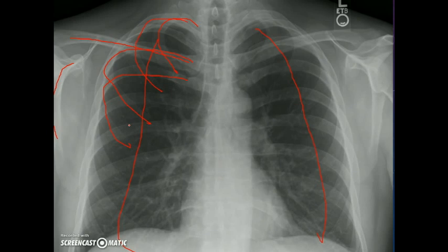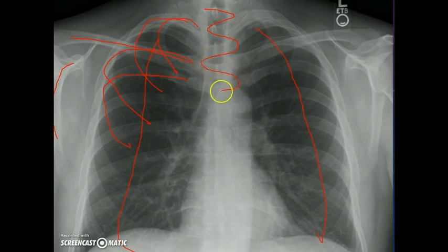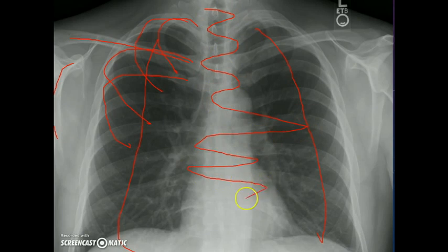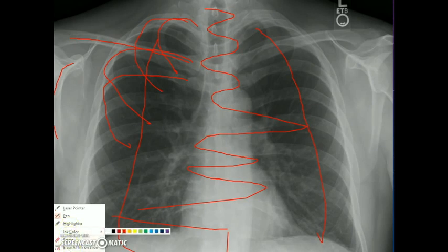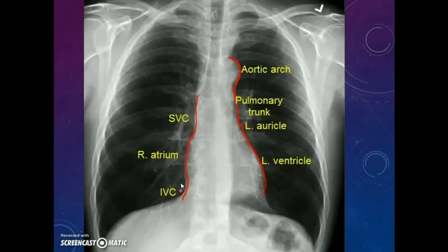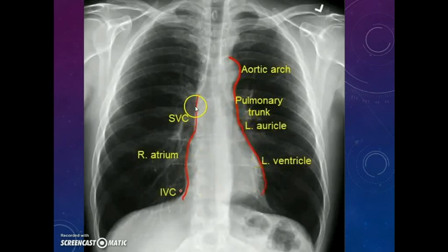After the bony skeleton, go in for the mediastinum. Look at the mediastinum — you can see the trachea first, then the cardiac shadows. In the mediastinum, you will see the different parts: the aortic knuckle, the pulmonary trunk which appears as a concavity rather than convexity, the left auricle and left ventricle. On the right side, you will see the superior vena cava, right atrium, and inferior vena cava. The inferior border of the cardiac shadow is mainly formed by the right ventricle.